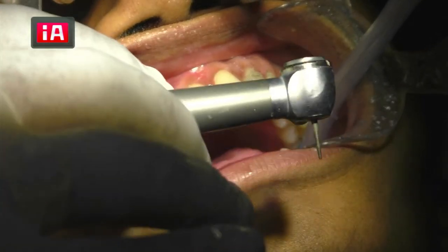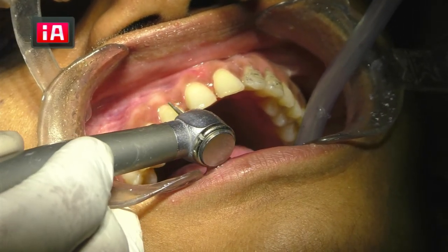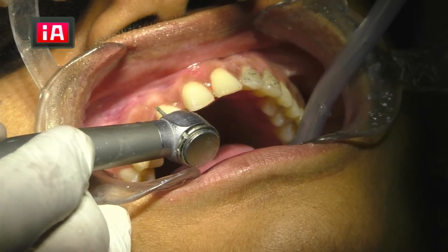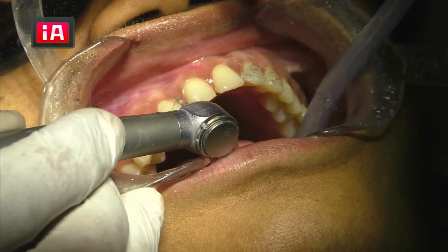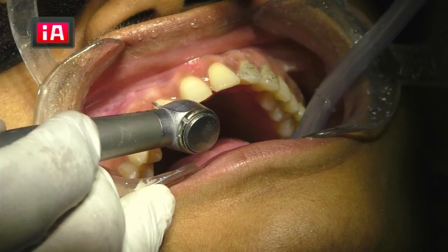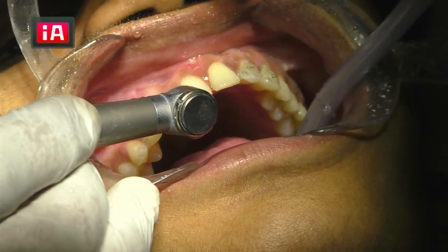The lateral is tilting. Okay, this here. So, this I have to correct. I have to really lift you more where the tilt is, so that tooth becomes straight. Otherwise, the laminate also becomes tilted. These are all the things you have to do according to the situation. You come with the experience.